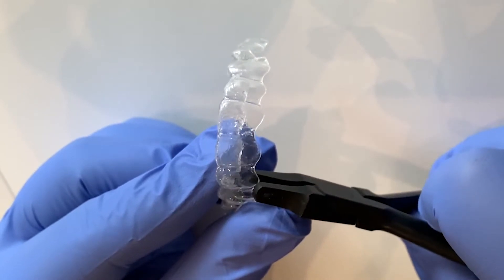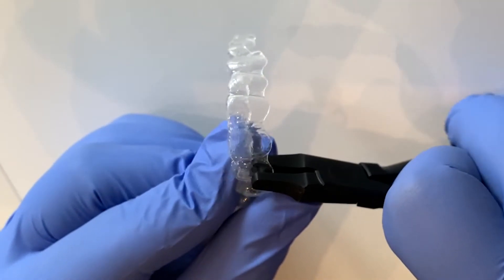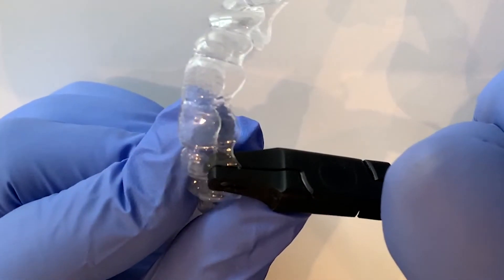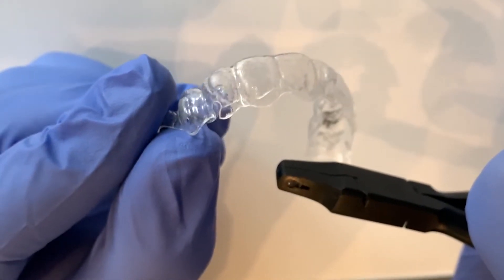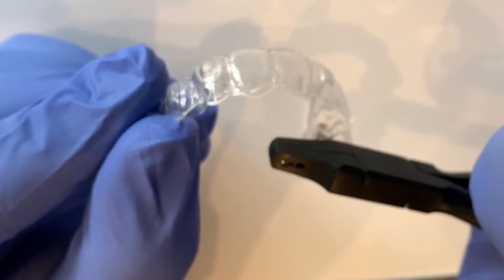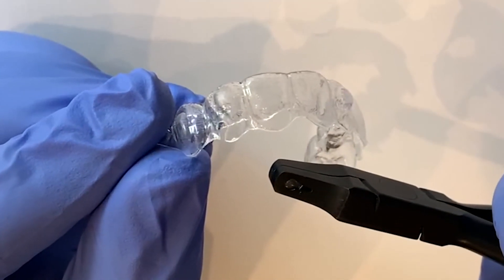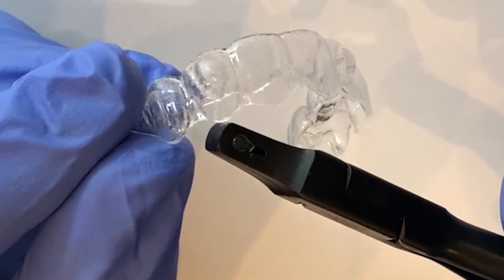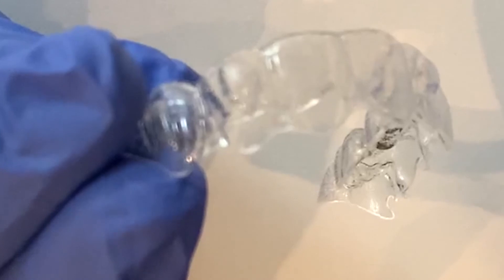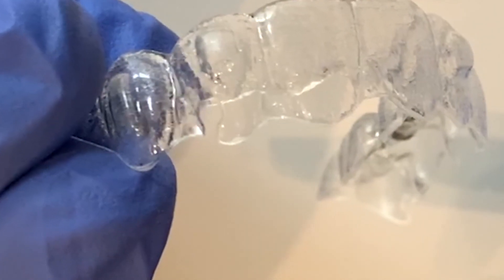We want to create a space for an elastic band. In this scenario of a lateral incisor that is not tracking, we have now placed a groove or shape that the elastic band can engage to allow extrusion of the tooth.